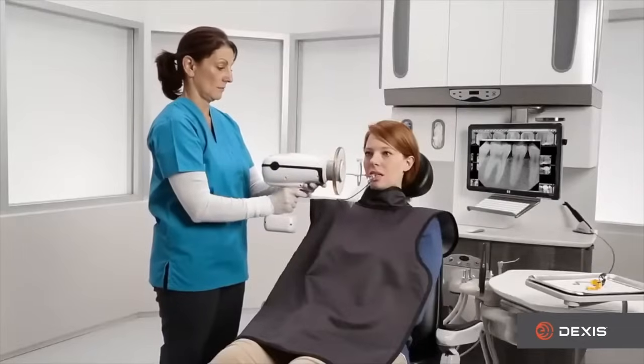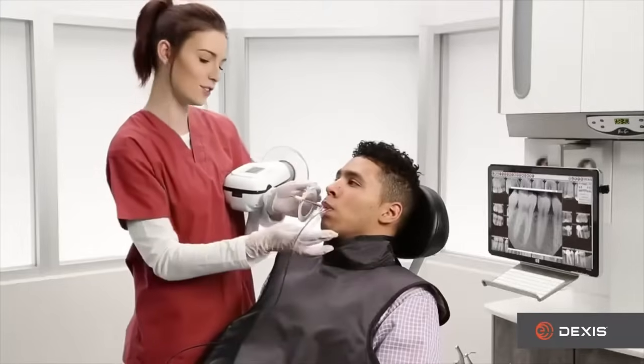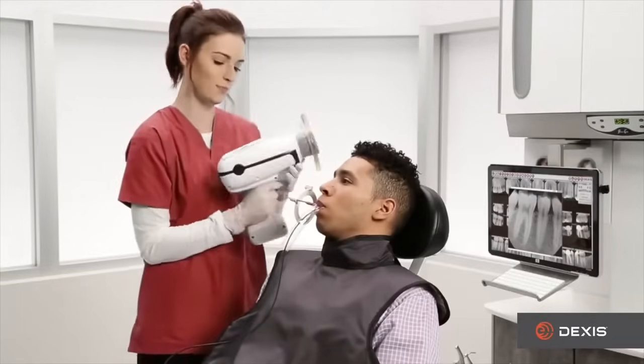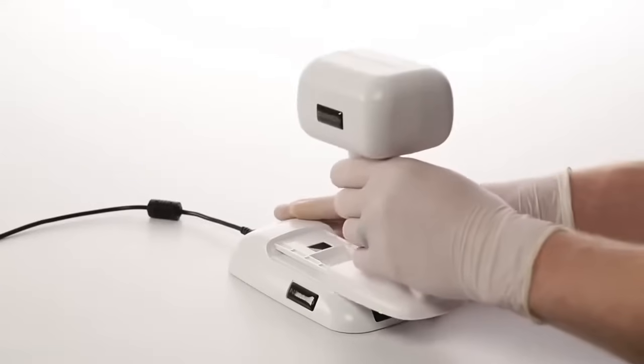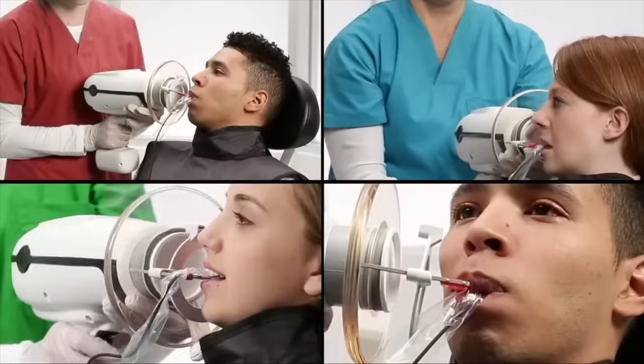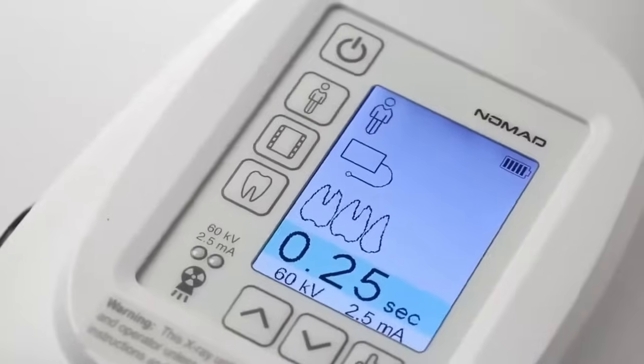When the Nomad is used as directed, these shields create a safe zone throughout the acquisition process. Unlike conventional wall mount and portable x-ray systems, the Nomad is lightweight, rechargeable, and can go anywhere. The handheld and portable design allows you to move freely between multiple operatories.